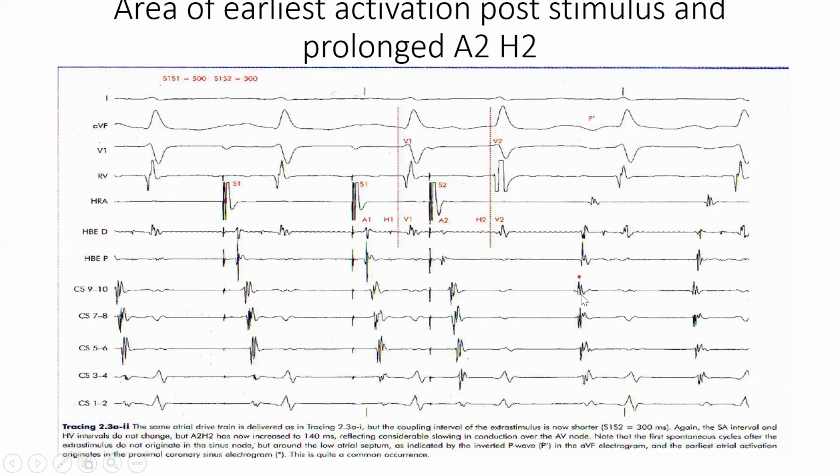So what we are saying to tell you is, look at this lining of everybody. Which one is coming first in all these catheters? Which one is coming first in activation? Can you see it clearly, sir? Yes, Prof, I can see it.